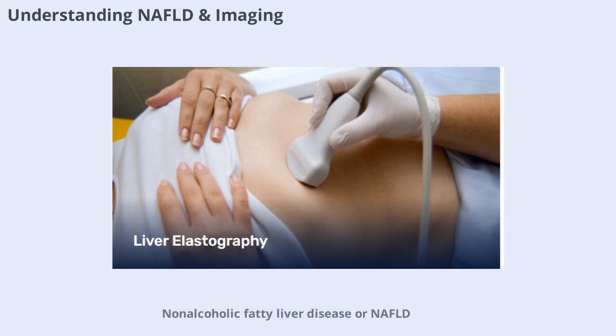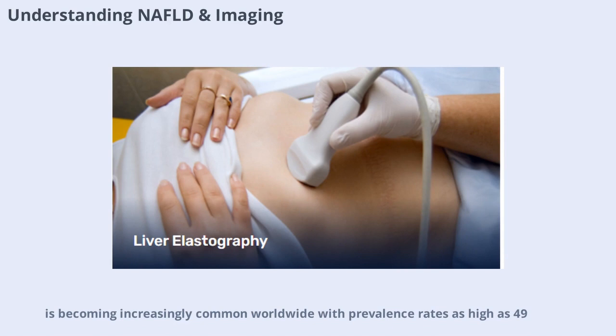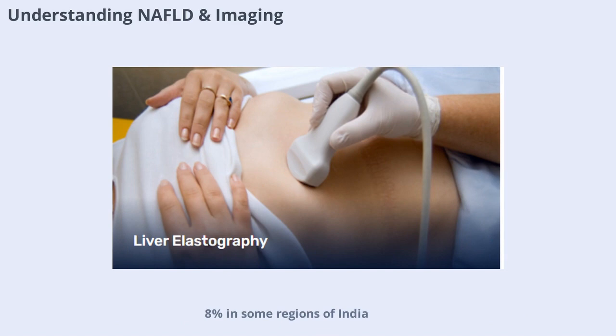Non-alcoholic fatty liver disease, or NAFLD, is becoming increasingly common worldwide, with prevalence rates as high as 49.8% in some regions of India. NAFLD covers a spectrum from simple fat accumulation in the liver to more severe conditions like fibrosis, cirrhosis, and even liver cancer. Traditionally, diagnosing and staging NAFLD relied on liver biopsy, which, while accurate, is invasive and uncomfortable for patients. As a result, non-invasive imaging techniques have become essential.